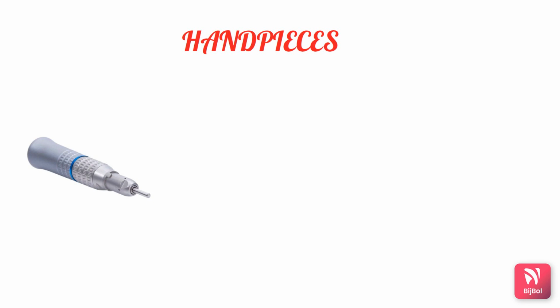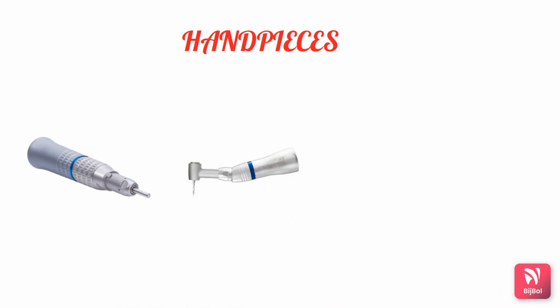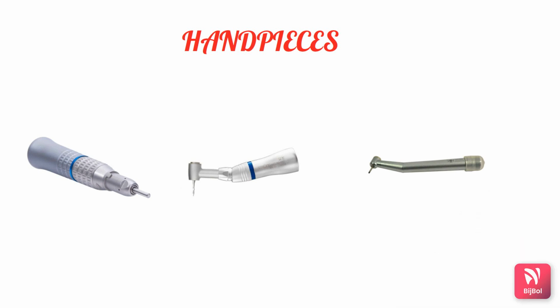Next, we can see the contra-angled handpiece. This is the primary handpiece used in the mouth. The head of the handpiece is first angled away from and then back toward the long axis of the handle. This is also one of the handpieces used frequently. In this contra-angle, we have the micromotor and the air rotor handpiece. The air rotor handpieces are connected to the air water line of the dental unit and can be activated by compressed air supplied by the compressor. The speed range is 2 lakh rpm.